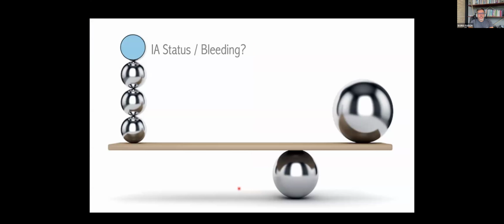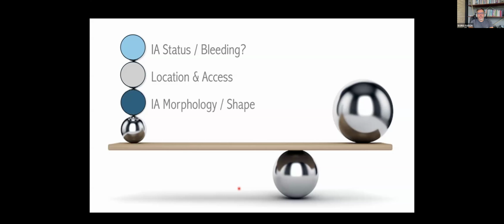So here it is essential to have the perfect balance regarding the clinical condition of this aneurysm, the location, how your access looks, your entry angle, whether it is necessary to pre-shape the microcatheter or not, how the morphology of the aneurysm looks, whether you are dealing with a classic wide neck bifurcation aneurysm, or if you are considering treating some highly selected sidewall aneurysm.